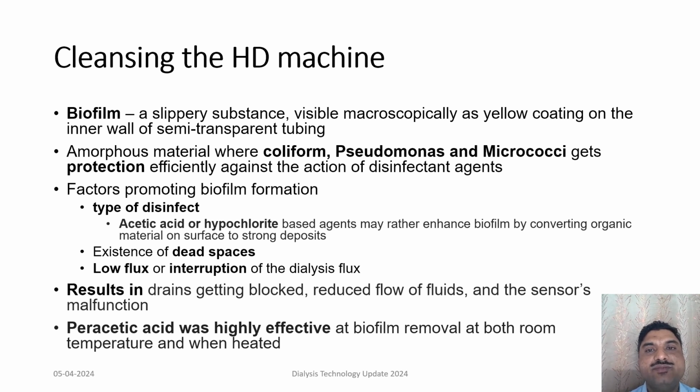So these biofilms then result in drainage blockage, and it will also lead to reduced flow of the fluids and sensor malfunction. What is important is that peracetic acid was found to be highly effective at biofilm removal both at room temperature and when heated.